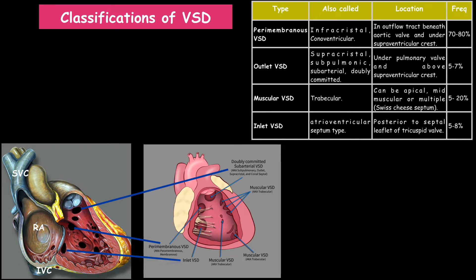Now let's see the various types of VSDs based on their location. First, the inlet VSD, also called the atrioventricular septum type. It is located posterior to the septal leaflet of the tricuspid valve. We can see the VSD in this image, and the frequency is around 5 to 8%.